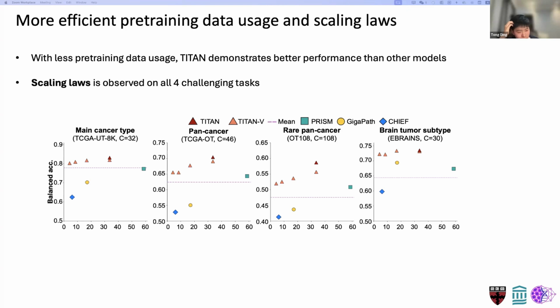I think one of the parts is what's the best way to show off the model's performance, how to distinguish it from previous slide foundation models, so we had to curate those rare disease retrieval data sets. We had to find those challenging tasks to evaluate on.